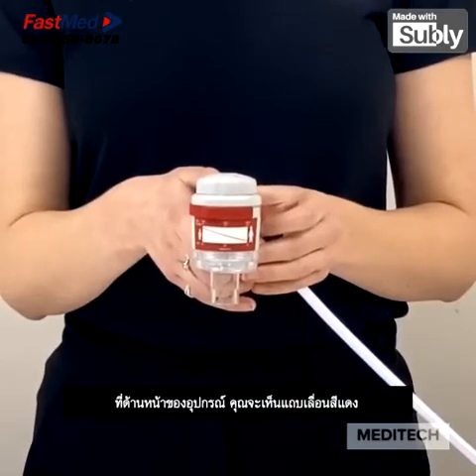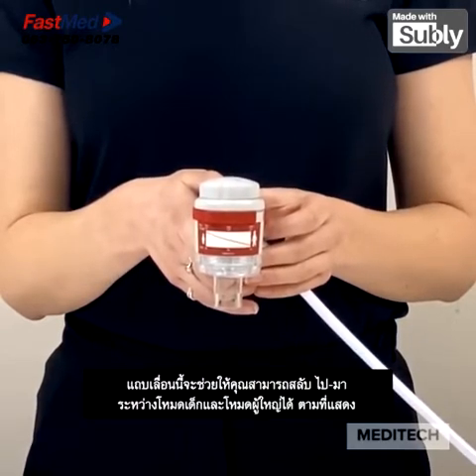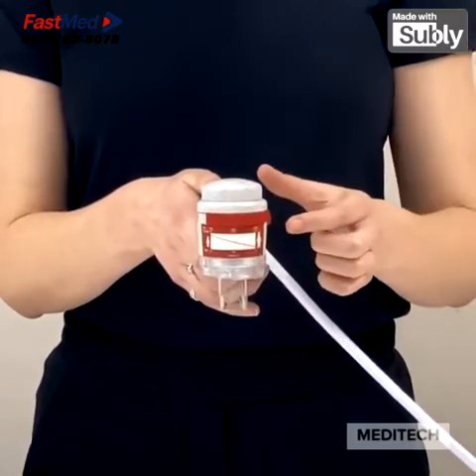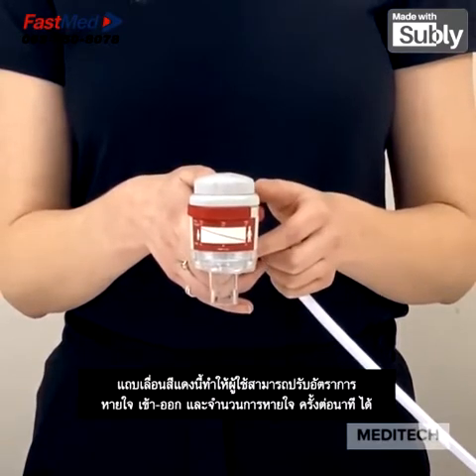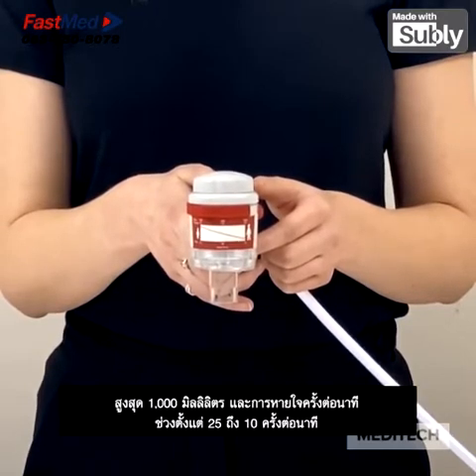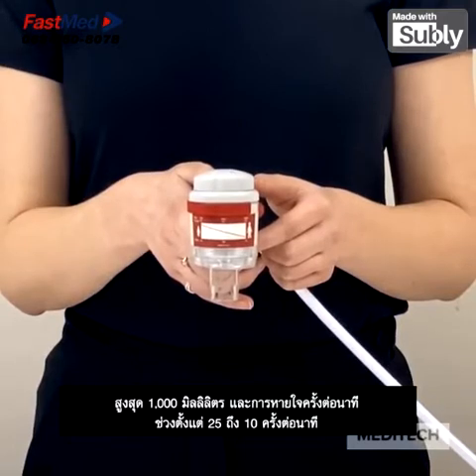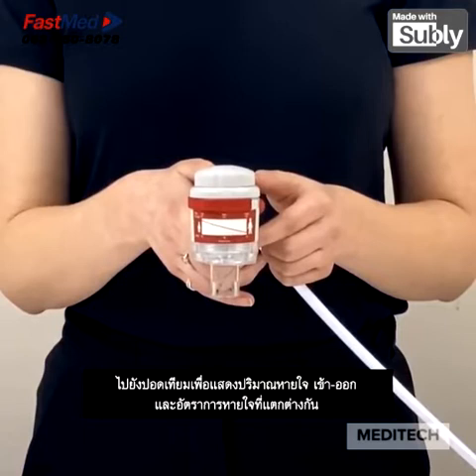At the front of the device you will see a red slider. This allows you to switch between child and adult mode as shown. The red slider allows the user to adjust the tidal volume and breaths per minute accordingly. The device we are looking at today has a tidal volume range from 150 millilitres up to 1000 millilitres, and a breath per minute range from 25 down to 10 breaths per minute.